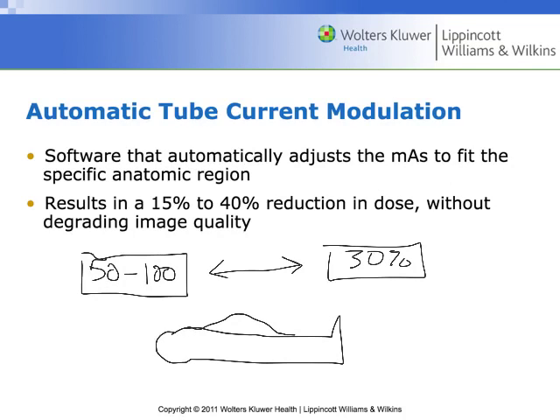So if I'm x-raying this mummy here, who's wearing a false beer belly, the machine is going to be getting a kind of feedback loop of information from this. So it's really important, if you're using this kind of program, when you do your scout images, for there not to be any shielding or car keys in the person's pocket. Even though I can see through that, please remove your cell phone, your wallet, your car keys before you go into the CT suite.